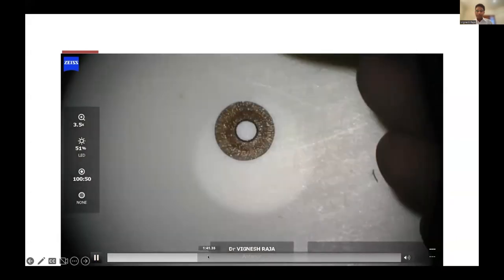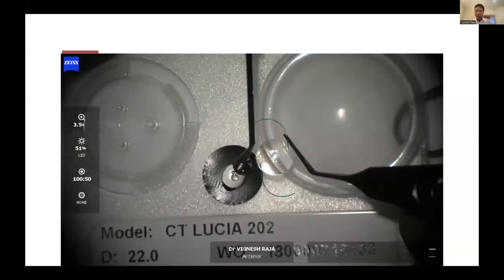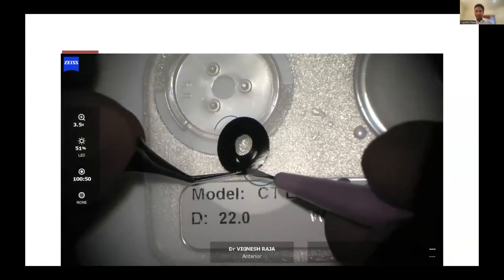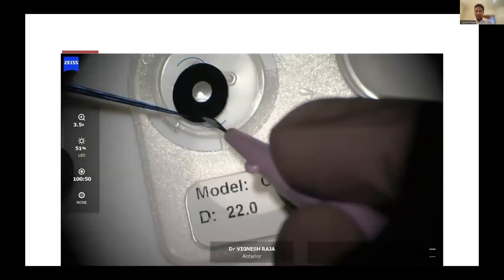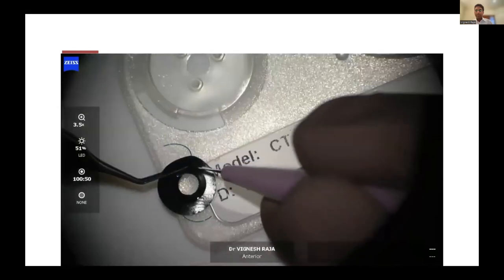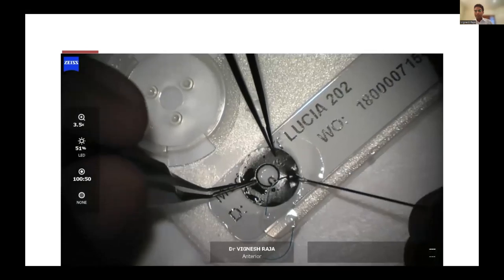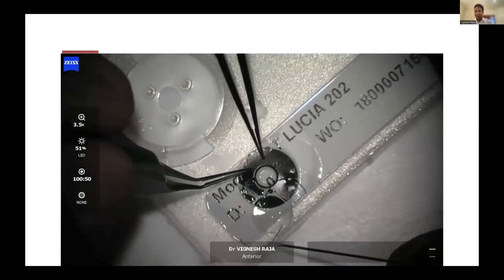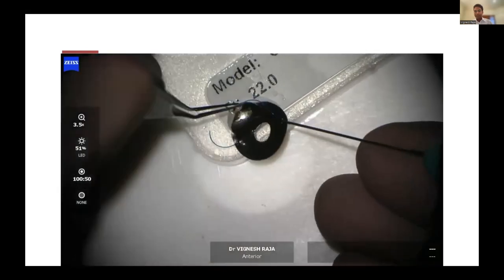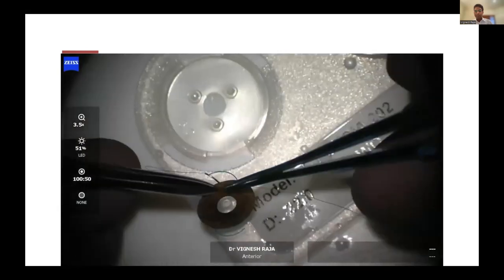Now what I'm doing is taking a 15 degree blade and making 2 slits, 1 millimeter apart. And so I'm making a belt loop in the iris so that I can pass the blue haptics through that. Passing the second haptic is slightly tricky because you think the haptic is going to break, but because the CT Lucia lens is so good.